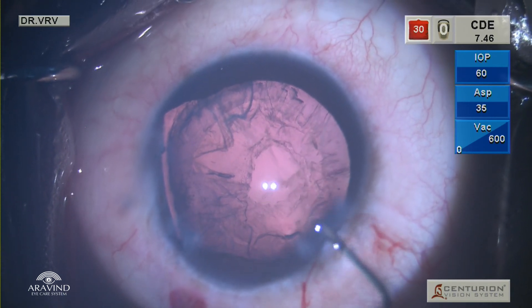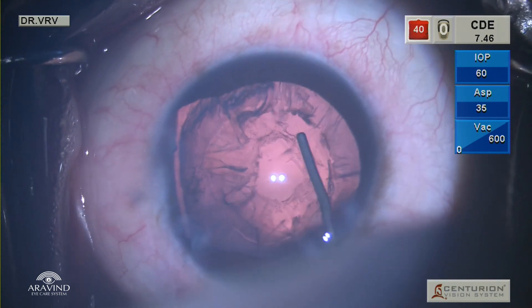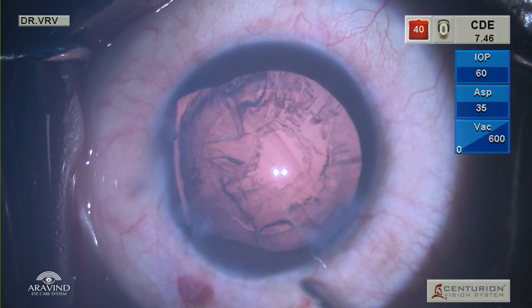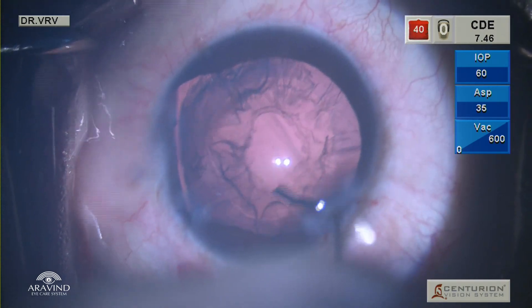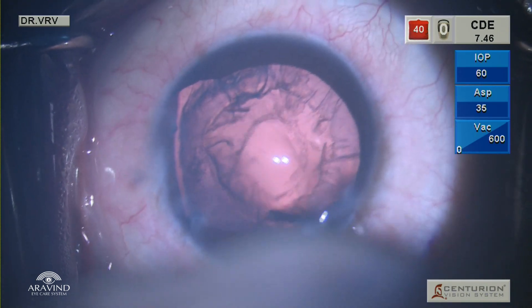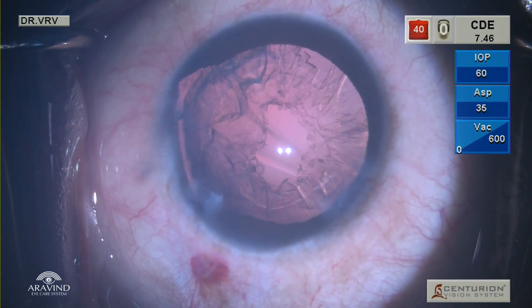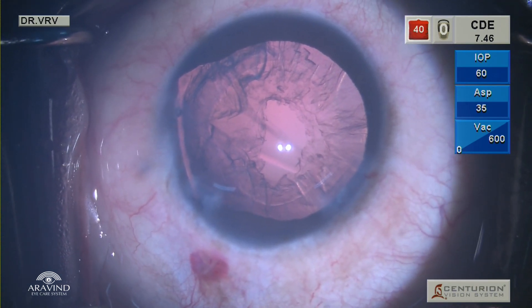In this particular case you can see there is no cortex in the center of the posterior capsule, which is a good sign. Using the hydrocannula filled with BSS, gently perform posterior capsular polishing, which helps in separating the cortex from the posterior capsule and also at the equator. As a result there won't be much stress on the zonules while removing the cortex.